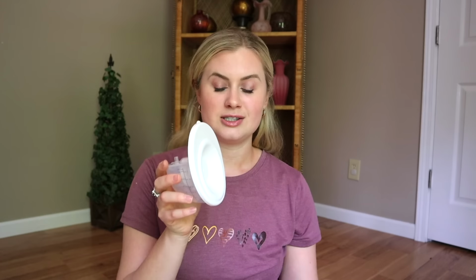So different lactation consultants will tell you different things about this. I know it's not recommended for NICU babies, but a lot of experienced moms will tell you this trick, and it's really helpful to put your parts in the fridge between different pumps of the day. So it's really nice that this pump comes with this cover. I feel like that makes it all a little more sanitary even.